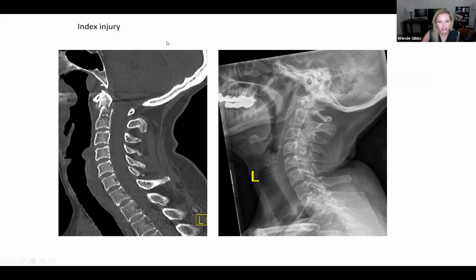So you asked what's here. You do still have displacement of the superior fragment of the tip of the odontoid. It's pretty small, but it doesn't look like it's healing at all. So that's the fracture day one. That's the fracture when she fell down. Oh, that's day one. So you're comparing it to an X-ray then? Yeah, this is the X-ray standing. That's her X-ray standing, and that's the supine.